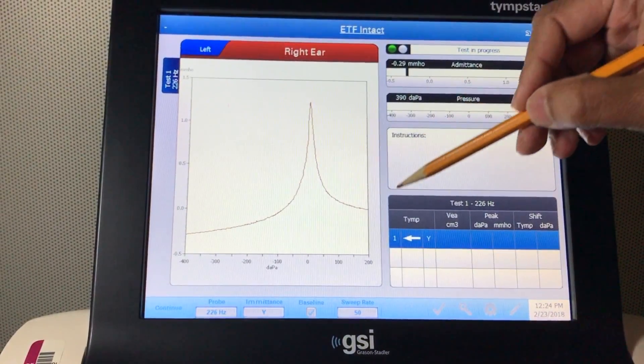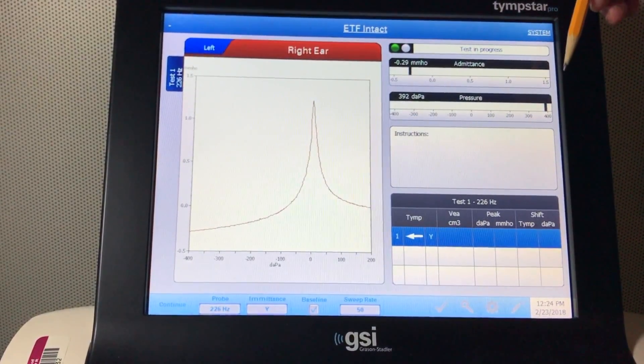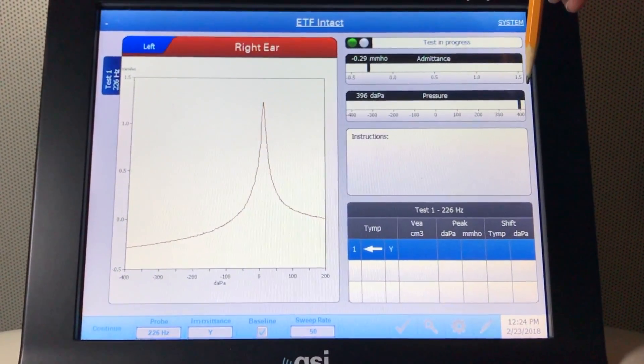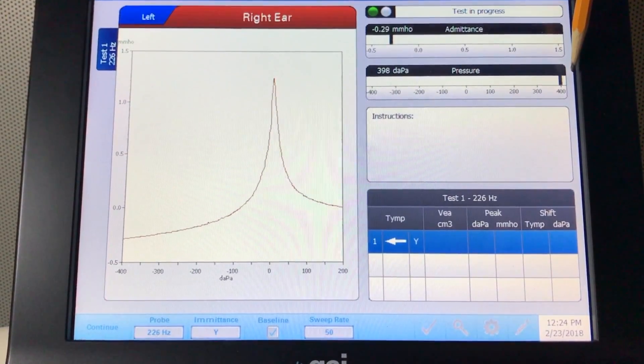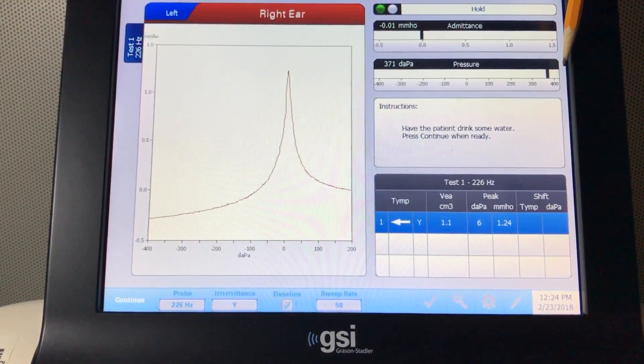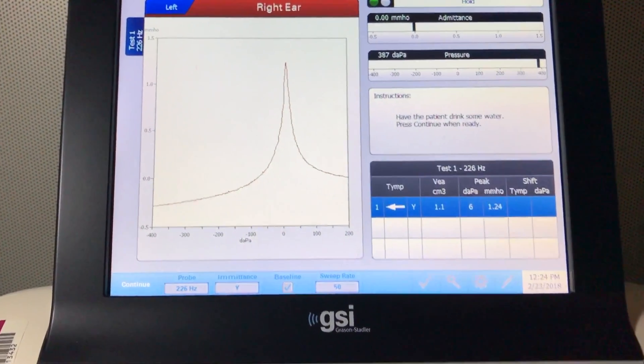Once you get the baseline tympanogram, the next thing the instrument does is it creates a positive 400 decapascal pressure in the patient's ear. Once the pressure is established, you have the patient drink some water.